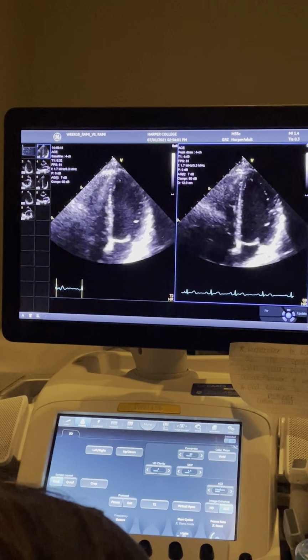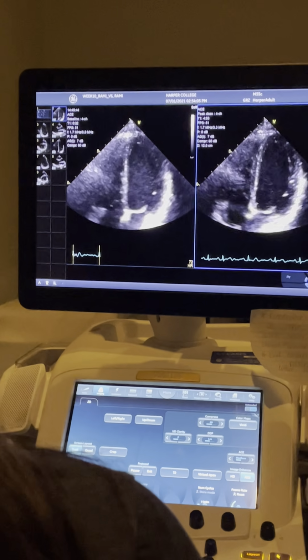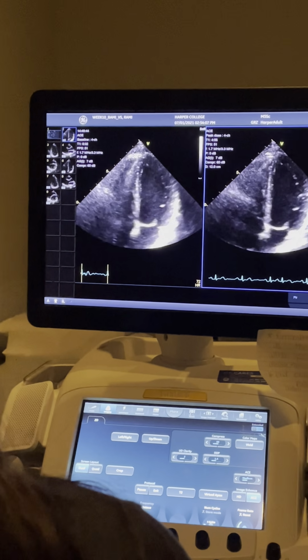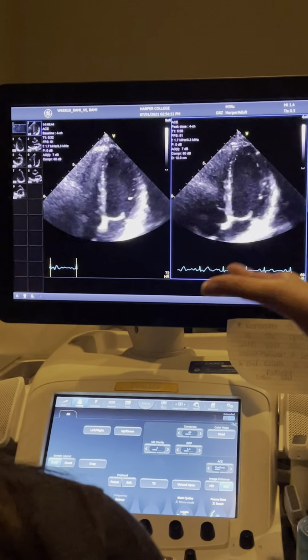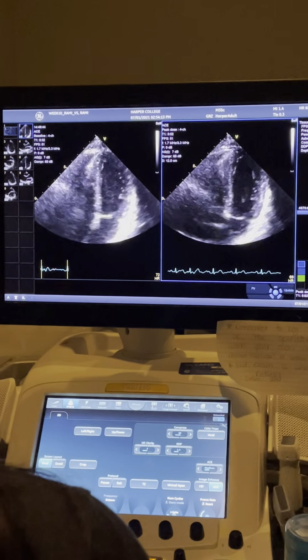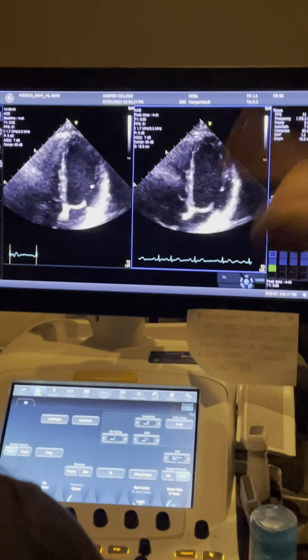That's why I can't teach you exactly how to do it, because you're going to have to learn it how your physicians want it, what your indication is. It tapers how you do an exam as well. So what pathology is there? Are they looking for ischemia? Then you're checking your LV. Are they looking at aortic stenosis? Then you need Doppler too. Whole different ballgame. We'll talk about that at the end here as well though.